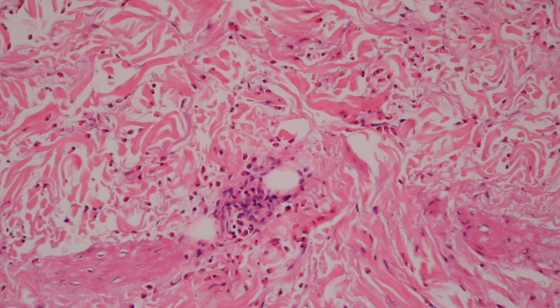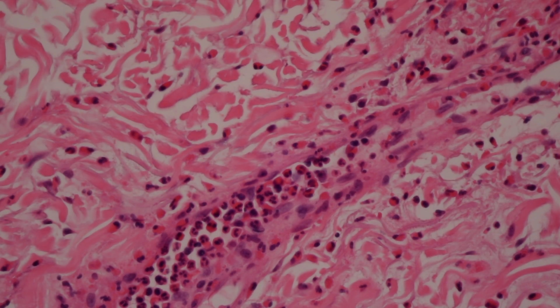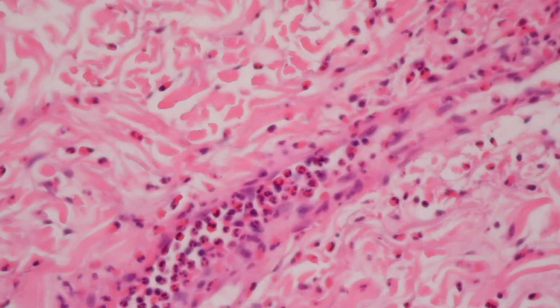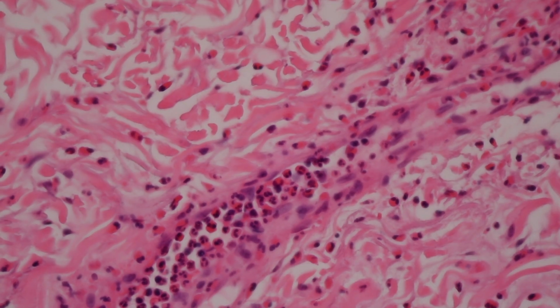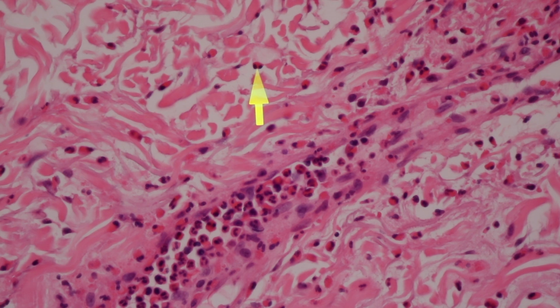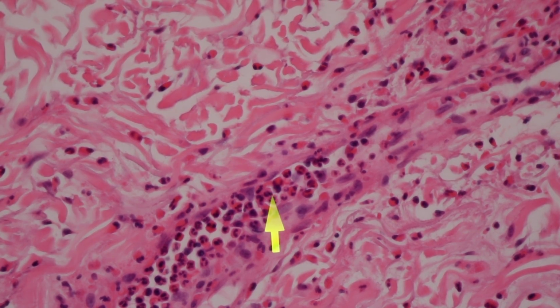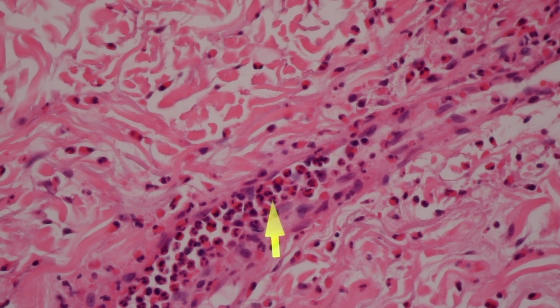You don't see much fibrin or anything, but what you do see is numerous eosinophils in addition to neutrophils that are spilling out of the vessels. It can be hard to tell apart neutrophils and eosinophils microscopically, and even harder, I think, on YouTube. But one thing you can do is go down to high power. If you see just 2 lobes to the nuclei, bilobed nuclei, they look like little sunglasses maybe, that's going to be an eosinophil. If you can see 3 lobes or more, then those are going to be neutrophils, okay?